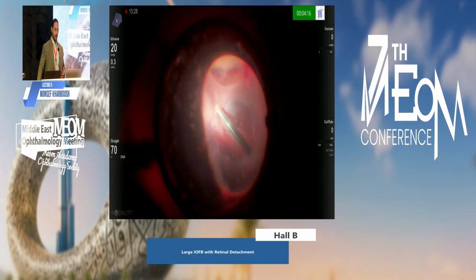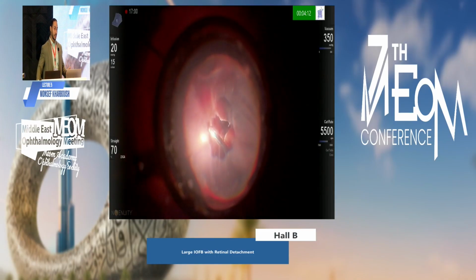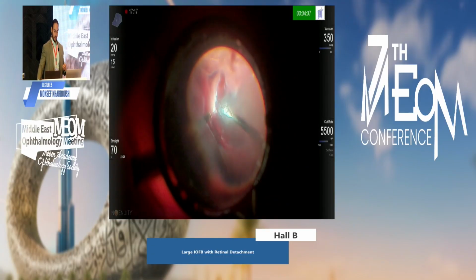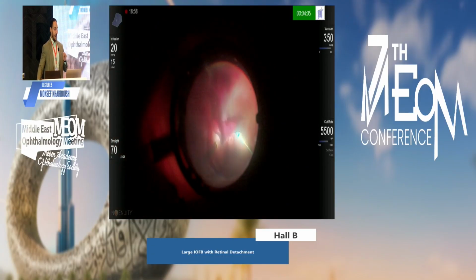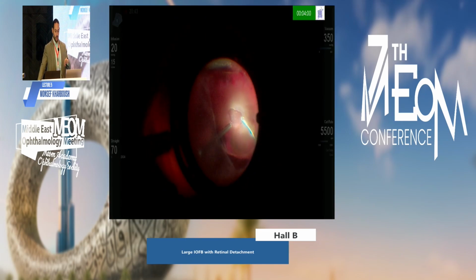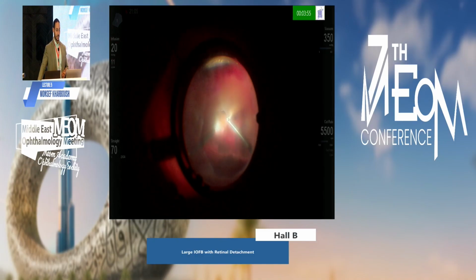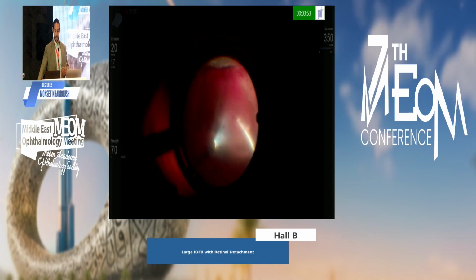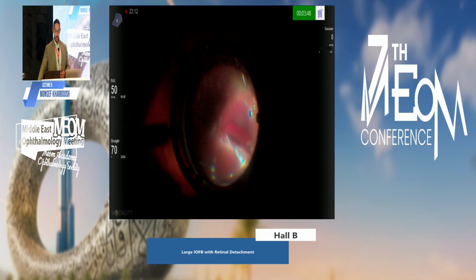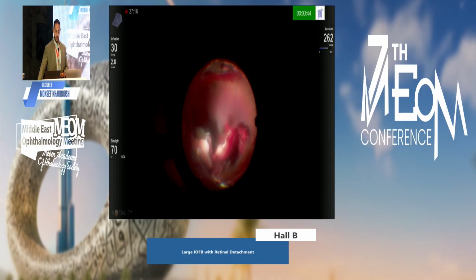Now, as you enter the vitreous cavity, you can see very dense organized vitreous hemorrhage. As we mentioned, the ultrasound showed a retinal detachment, so we don't know the level of the retina. So carefully trimming this organized vitreous hemorrhage and aspirating the liquefied vitreous hemorrhage layer by layer, sometimes opening a pocket of vitreous hemorrhage and aspirating, and sometimes organized vitreous hemorrhage like this, trying to pull it away from the retina, which is not evident at this moment. And we have many instances of extensive bleeding, so we shift to air to tamponade this blood.